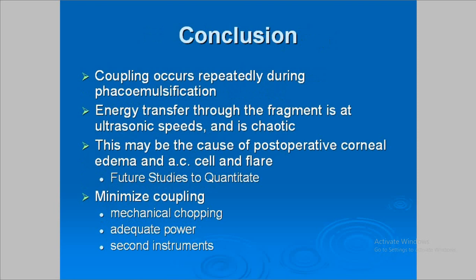The next phase of this study will be to use microprobes to actually analyze the energy being emitted, and I hope to report to you next year exactly how much energy is really being emitted by these phaco fragments. But coupling certainly seems to be an issue which we need to think about as we're performing phacoemulsification.